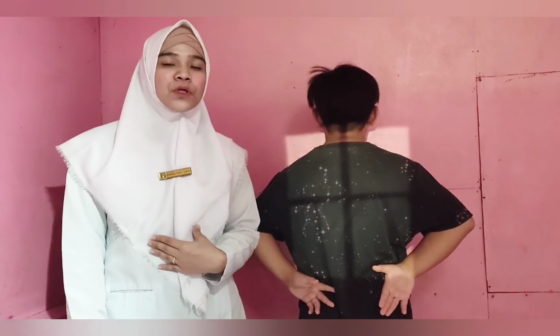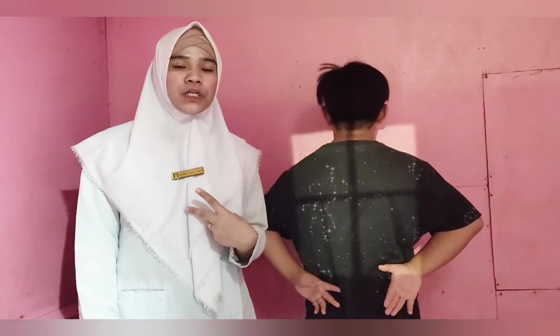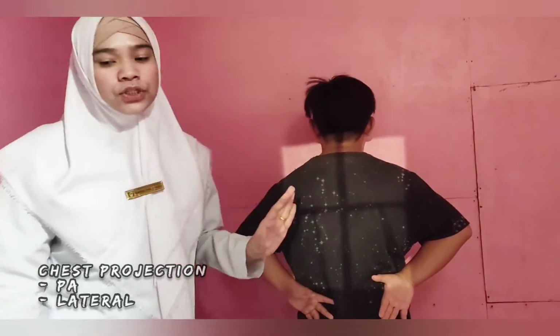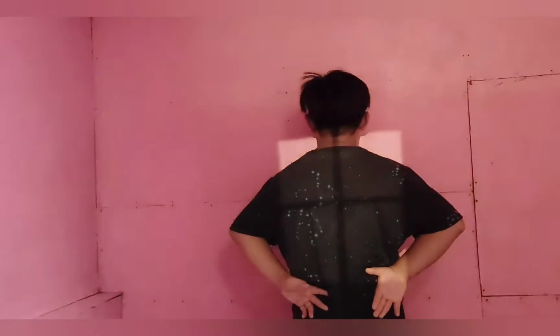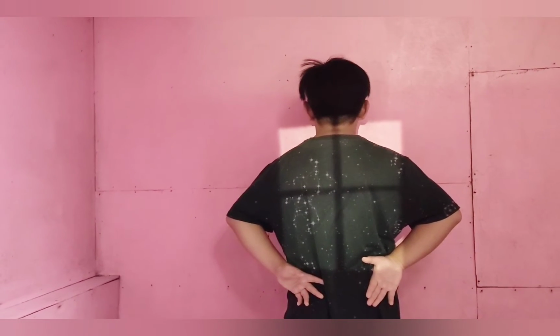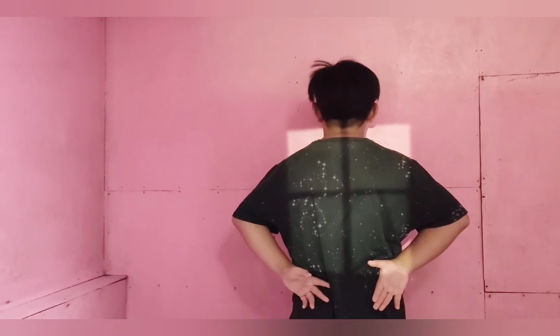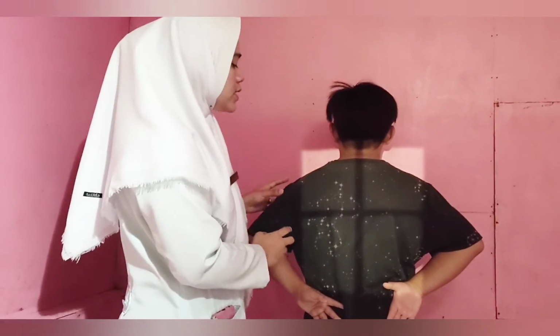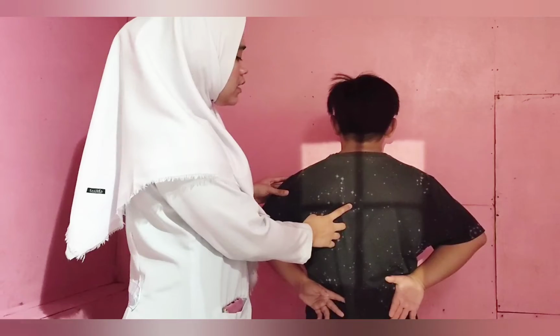So let's start. This is the chest projection. For the chest we have two basic projections, the PA and the lateral. This one is the PA projection. Patient must be erect, feet spread slightly, aligned with sagittal plane with CR. Then ensure that there is no rotation of thorax. CR is perpendicular to IR, centered to mid-sagittal plane at the level of T7.